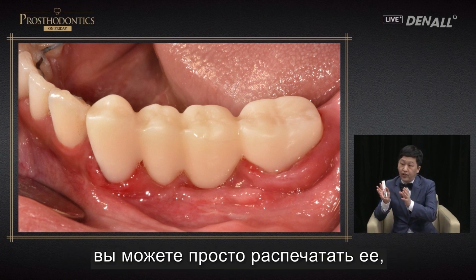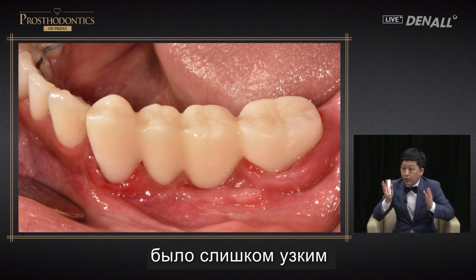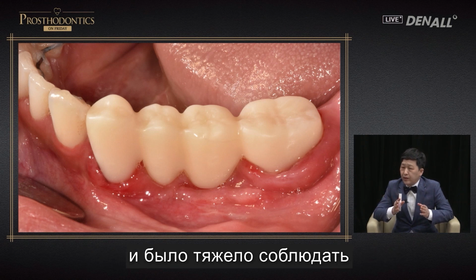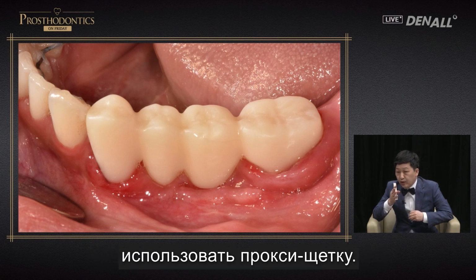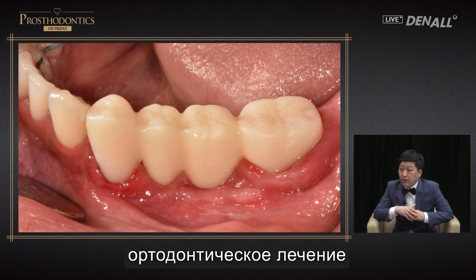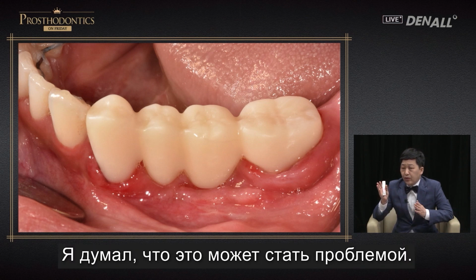In doing prosthesis design, if there's no major issue with the crown that has been designed with PMMA, you can just print it out exactly the same using zirconia, but the gingival embrasure space was too tight and oral hygiene was difficult to maintain. The patient should be able to use Proxa brush. The patient had been doing orthodontic treatment for a long time, so there was inflammation. I thought this could be an issue.